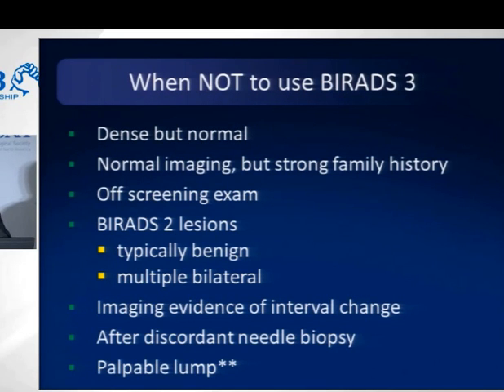And finally, palpable lump, which I just want to caution that you be very careful when choosing to follow something that is palpable.